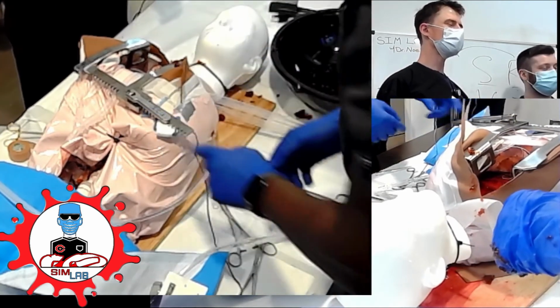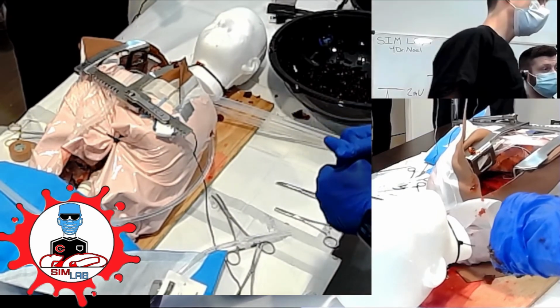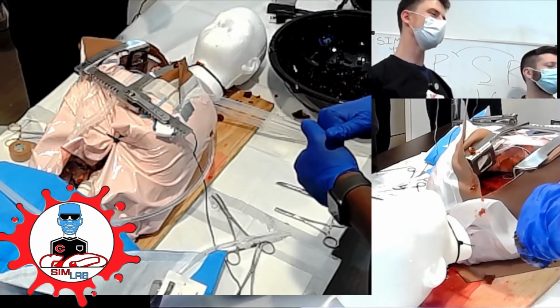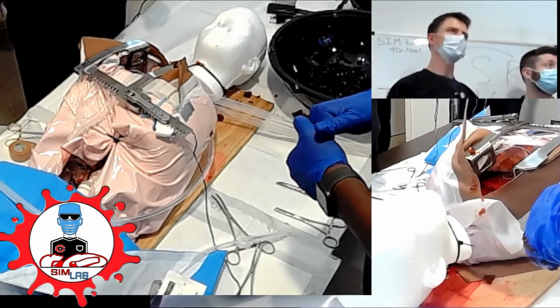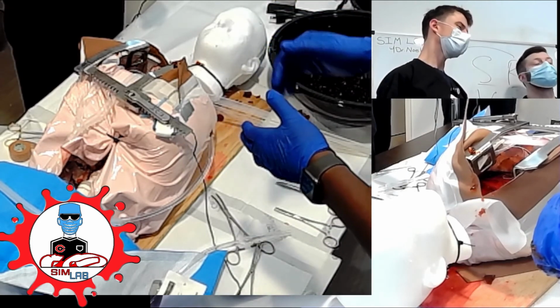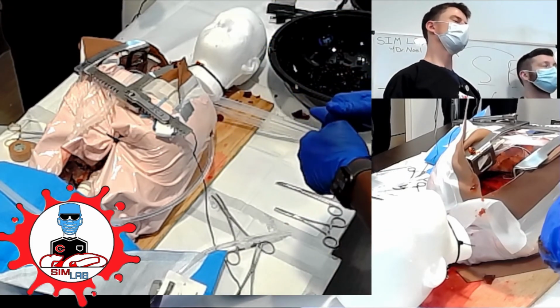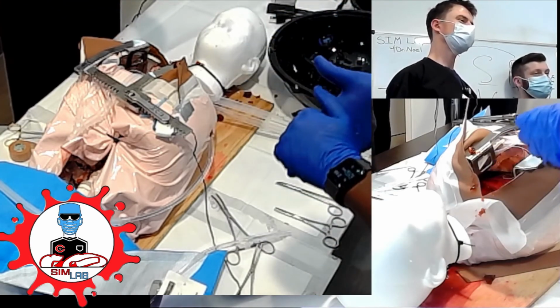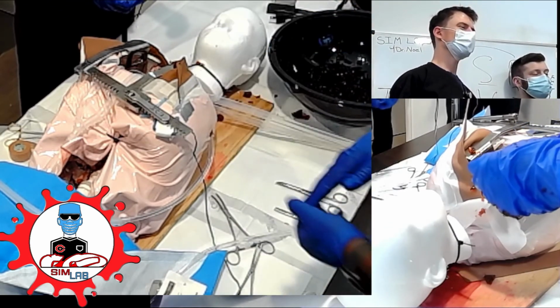Alright, so you shock them out. It looks like the heart is in some sort of rhythm, but there's no detectable blood pressure still. Okay, and no palpable. The heart is not beating? Heart's making some movements, wiggling, but there's no blood pressure. Not beating. We'll start internal massage. Okay. Do it.